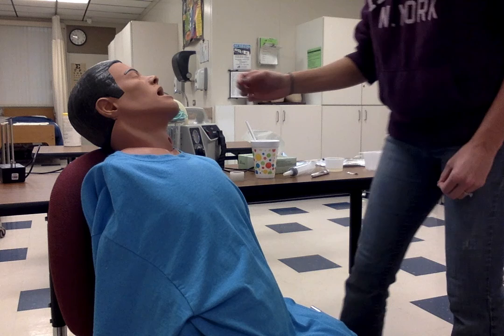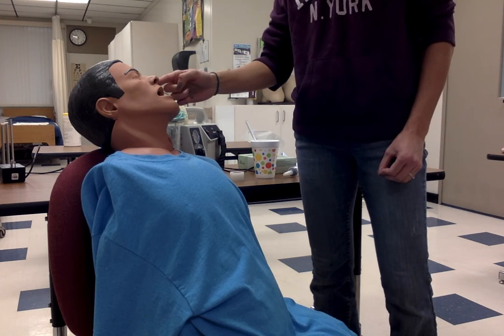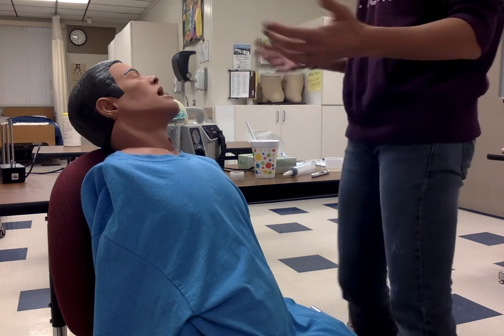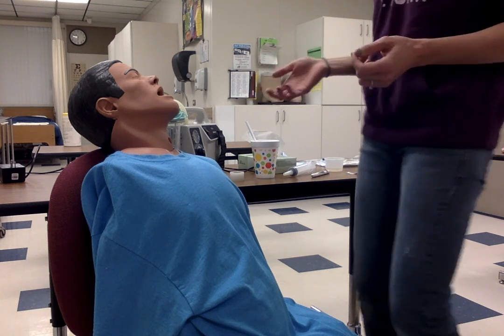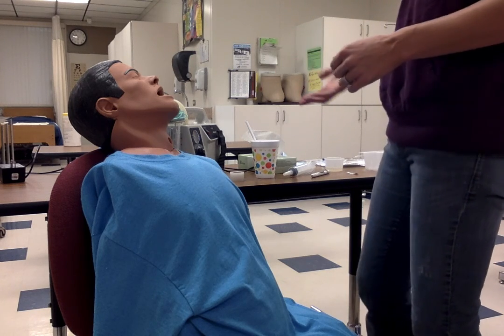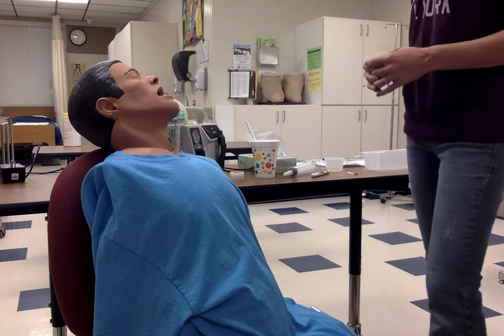So what we can do is plug each side, ask the patient to breathe, and then we can plug the other side and ask the patient to breathe and ask them if one or the other worked better. So for demonstration purposes, we're going to use the right nostril. So the patient feels that will work well, and that's the nostril that we're going to use.